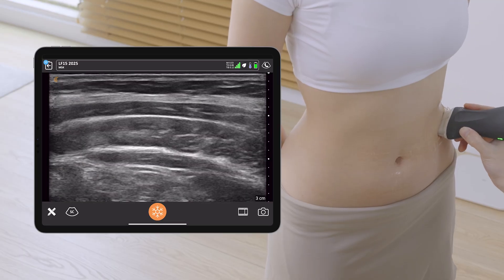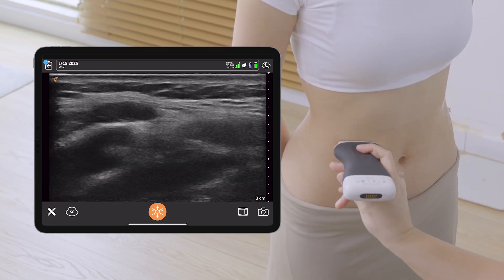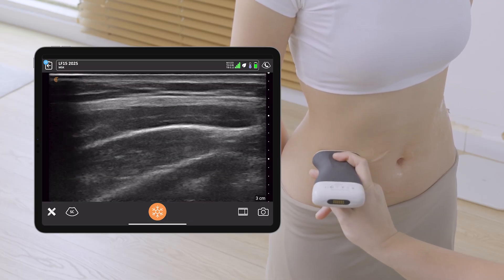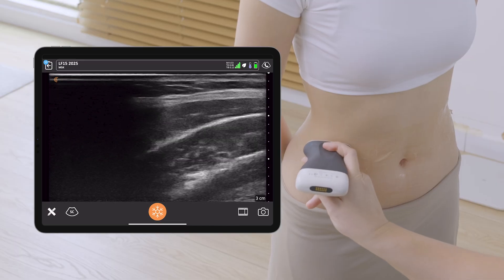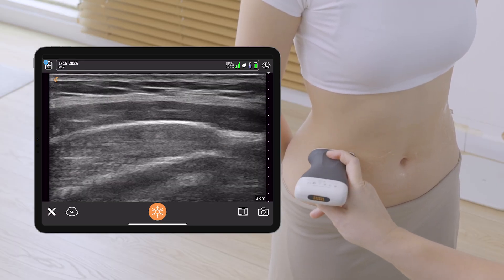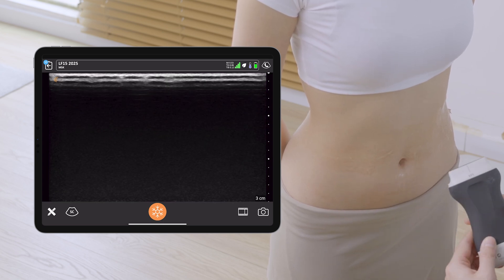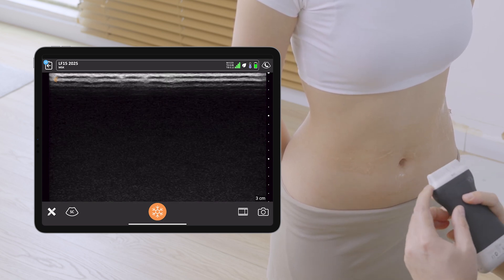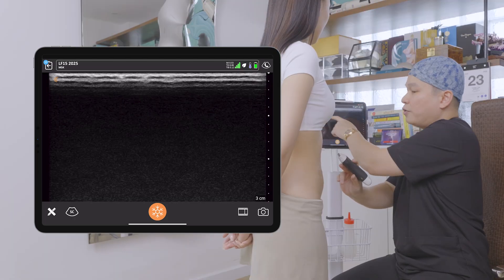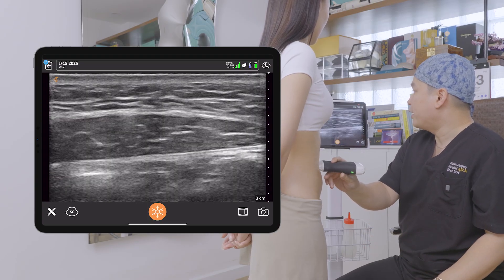Nothing abnormal so far. I scan the other side — the right linea semilunaris, oblique muscle group, and the waistline. The Clarius has a very friendly feature where you can see a notch, which is equivalent to the Clarius logo on the left side of your screen, so we can always be oriented.